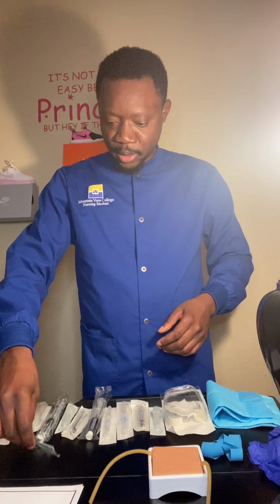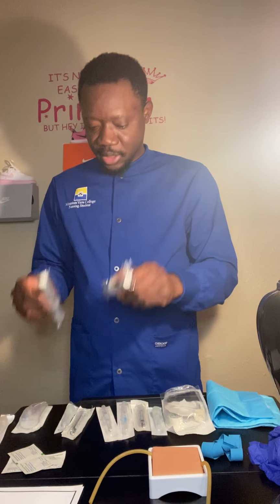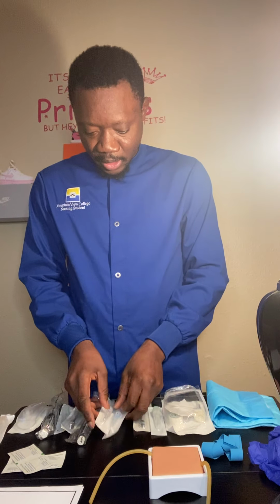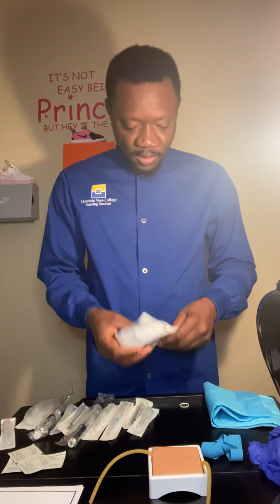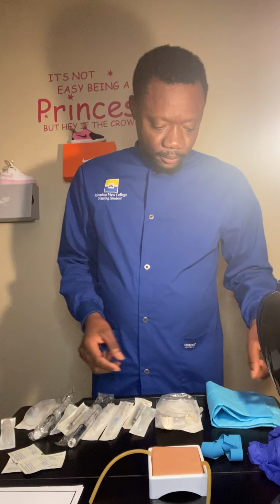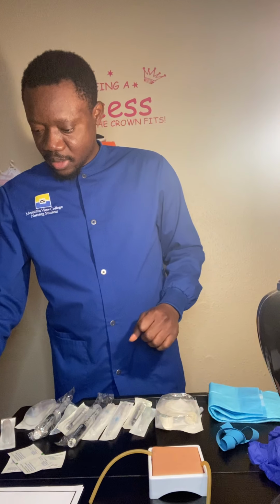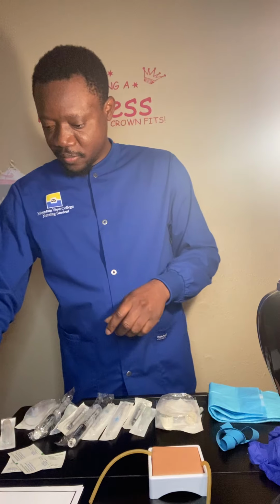So once I pull out my medication, I should go ahead and pull out my supplies. I have my alcohol prep, I have my saline flush, I have my syringes, I have my 2 IV. And it's imperative to know that I don't stick my patient more than 2 times. If I couldn't get it done in 2 times, I will let someone else try. Okay, I have my catheter extension, I have my syringes, I have my IV starter key, I have my pad, and I have my tourniquet. So I already got my skinny tapes. I got a lot of them on my side of the table.